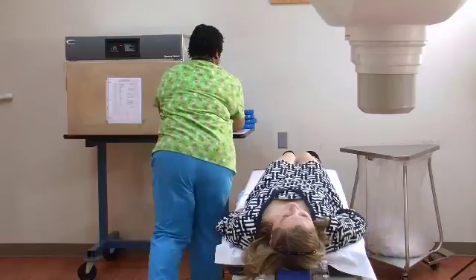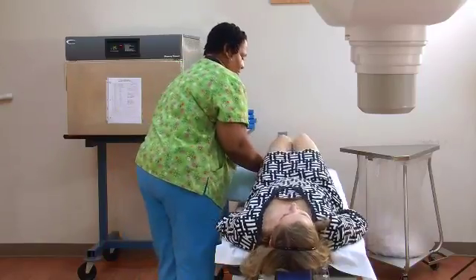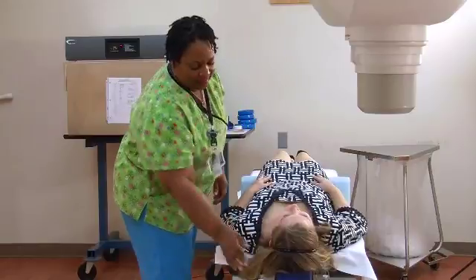If you look at surgery versus radiosurgery, the radiosurgery is definitely less invasive. There's no anesthesia. They're just resting comfortably in the treatment facility. The treatment's delivered, it's painless, and they go home the same day.